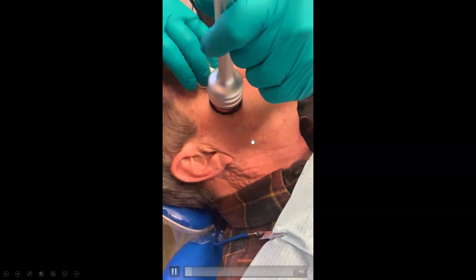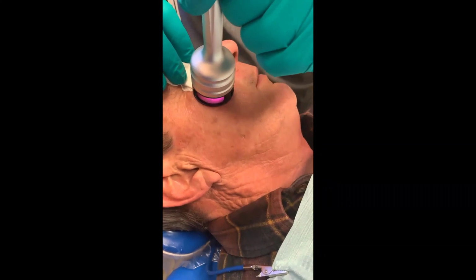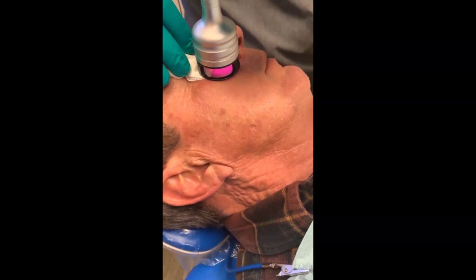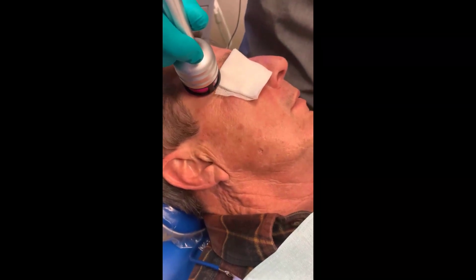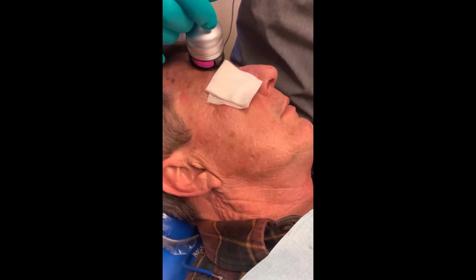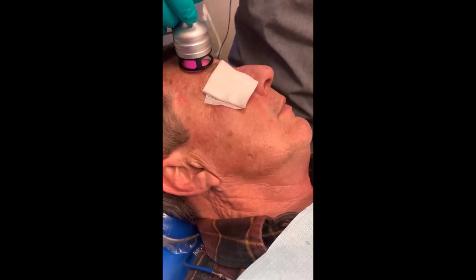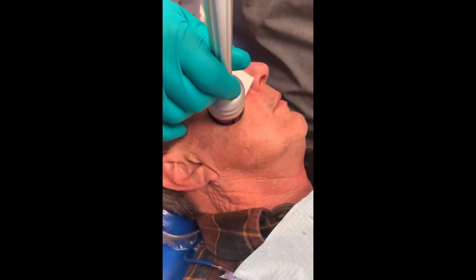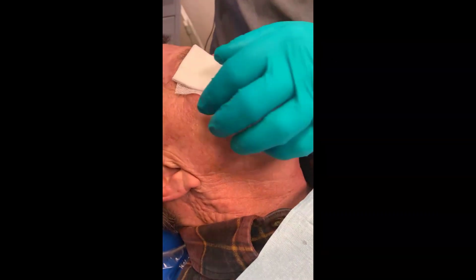And it should be somewhere around here you'll see movement. This is painless. The patient can't wear safety glasses, which you have to normally wear, so we've covered his eyes with gauze. But I'm following the innervative path of the nerve, and look, you just see a little something right there. That wasn't breathing. Breathing was down here, but you saw a little something right there. Again, you see a little something right there. So we're following the path of the nerve. So you see, that's what we did.